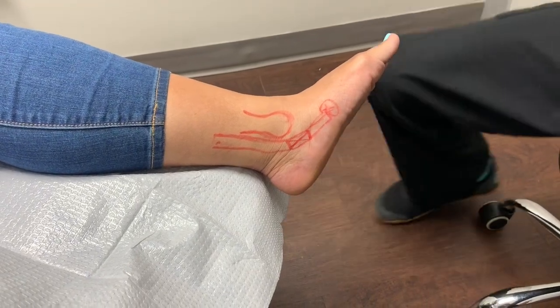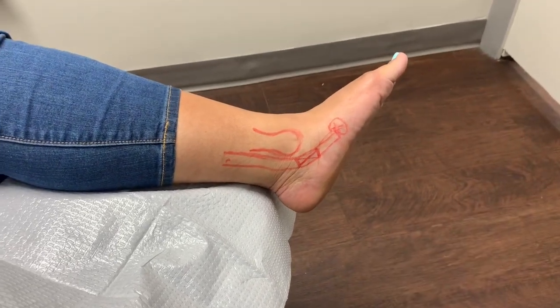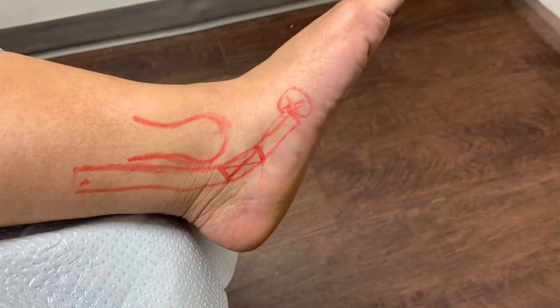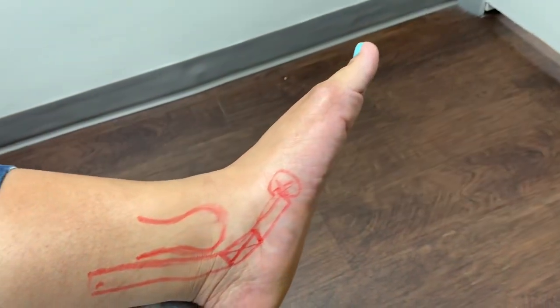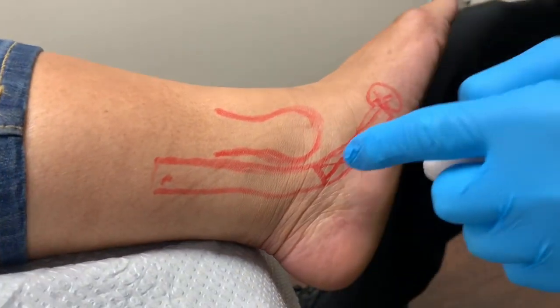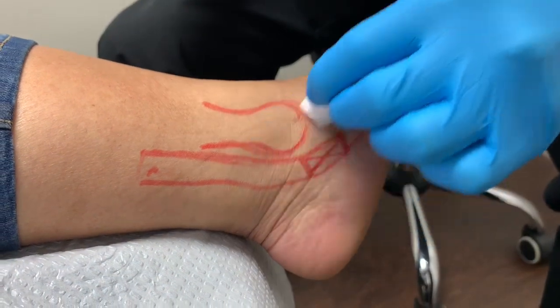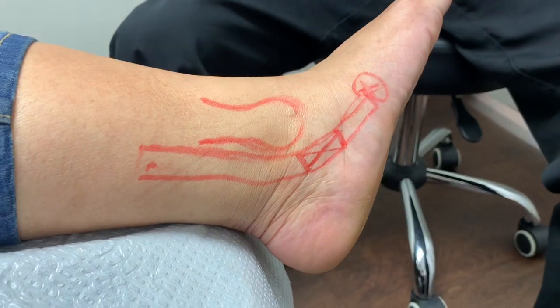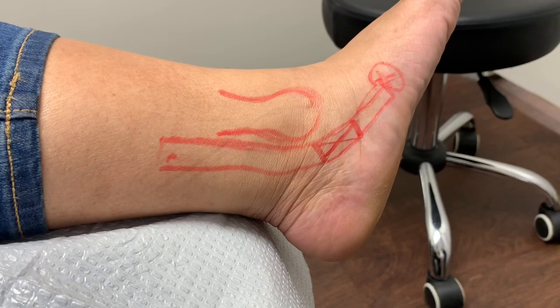So the first thing I'm going to do is go ahead and anesthetize the area, right? Because, like I've said before, PRP is uncomfortable. Okay, this is alcohol, and I'm gonna go ahead and use a little bit of lidocaine mixed with a little bit of Marcaine.